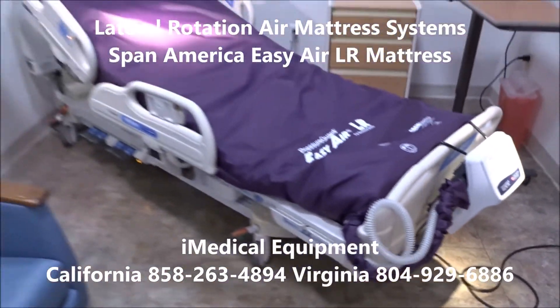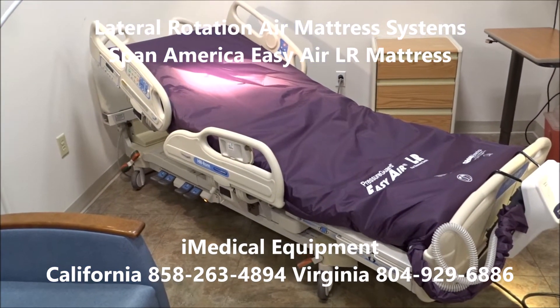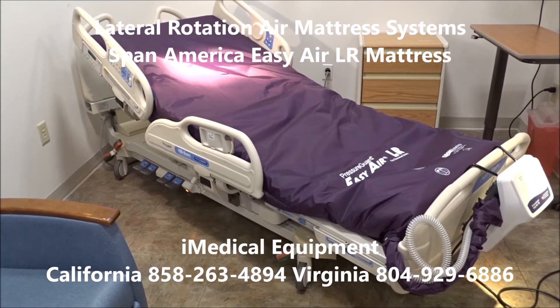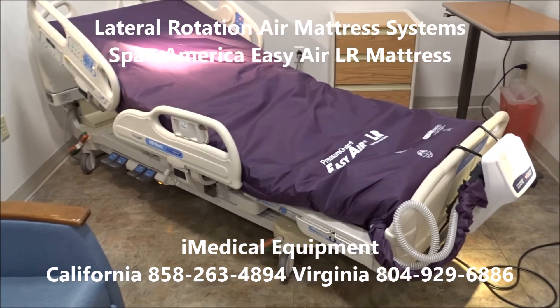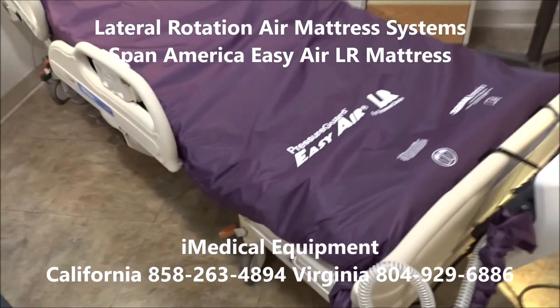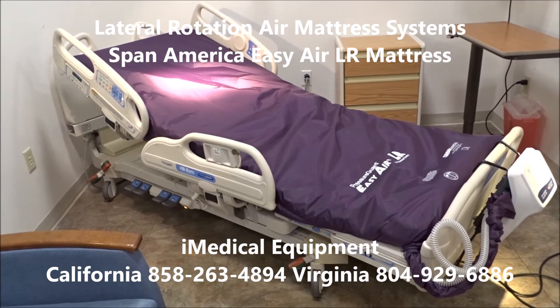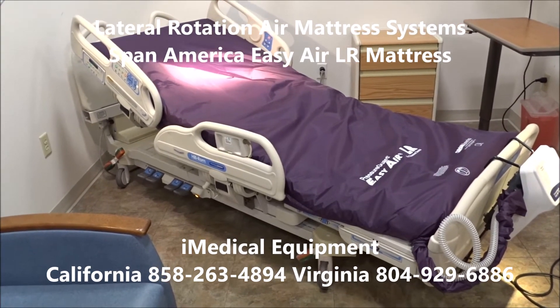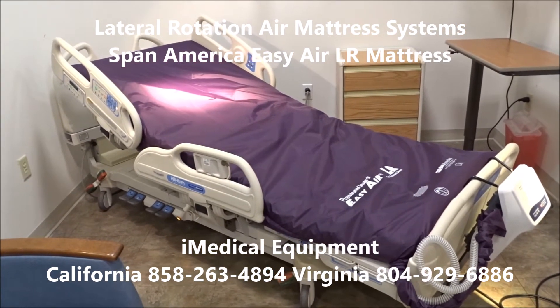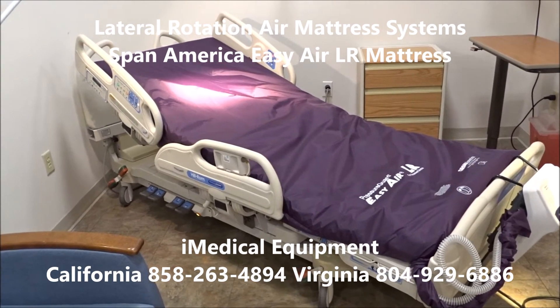When you get this mattress system and put it on the VersaCare bed, you're basically getting all the features except for the percussion feature. This bed does have a chair position. One thing that's also nice about the VersaCare is it sits a lot lower to the ground than the Total Care — about six to seven inches lower — which makes a big difference, making it easier to get in and out of bed. This bed and system is going to be almost completely problem-free. The VersaCare is the most reliable bed Hilrom's ever made.